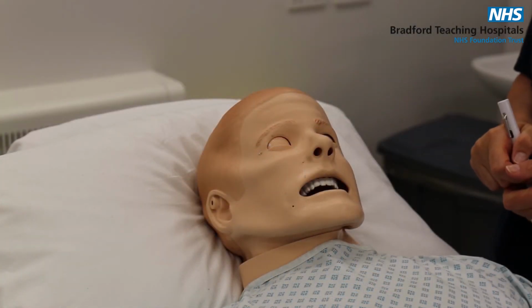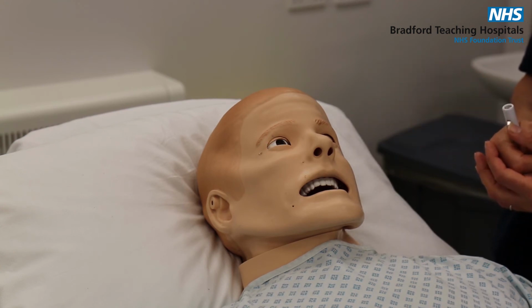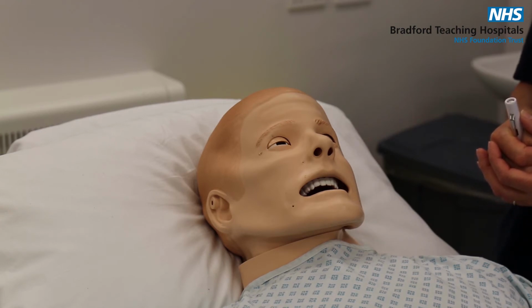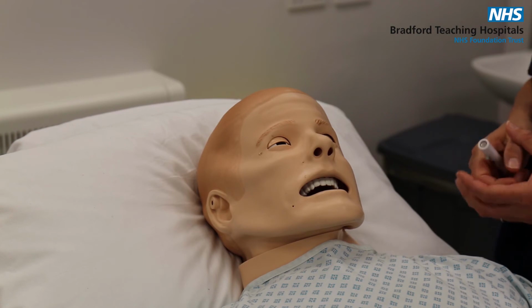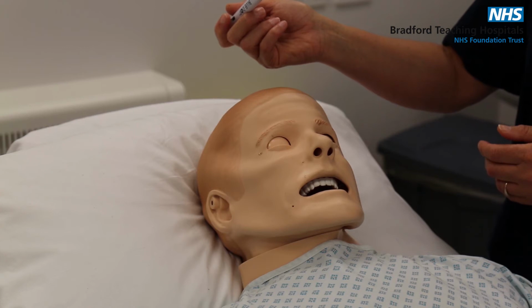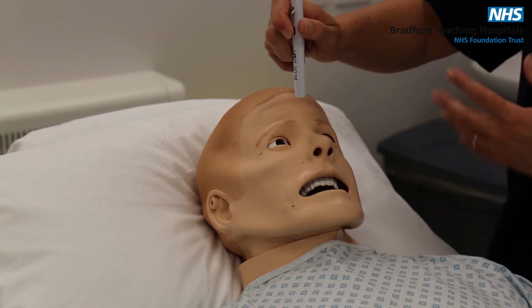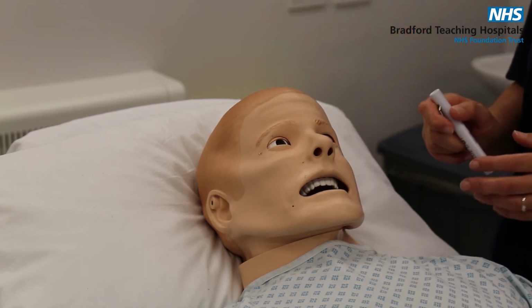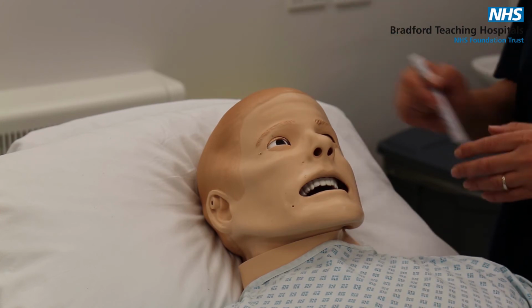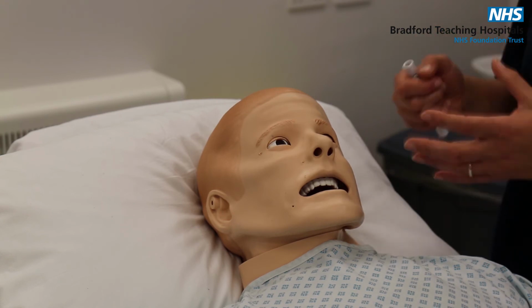So his eyes can be open, he can blink spontaneously, or he can have them fully closed, or they can be half open, half closed. His pupils will also react to light. If you pass the light source across the eyes, then the pupils will react accordingly. He can have either normal pupils, pinpoint pupils or blown pupils, and it's important that you check both eyes because depending on the scenario he could have either one pinpoint or one blown and the other one normal.